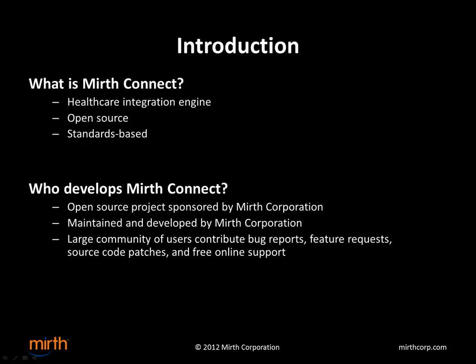So the first question I need to cover is, what is Mirth Connect? So Mirth Connect is a healthcare integration engine, and it's open source and standards based. I'm going to cover a little bit more in the next slide or slides what exactly that means.